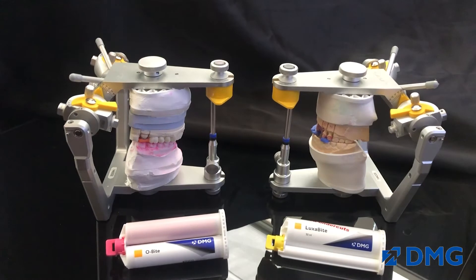I typically use two different types of bite registration material for my indirectly fabricated restorations. The first one is the polyvinyl siloxane material like Obite from DMG.